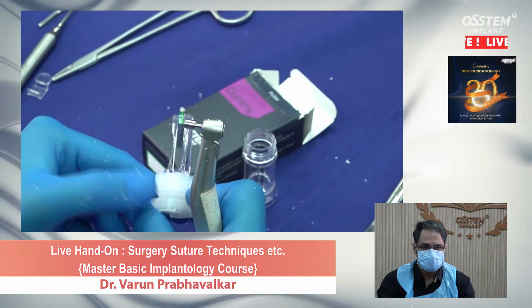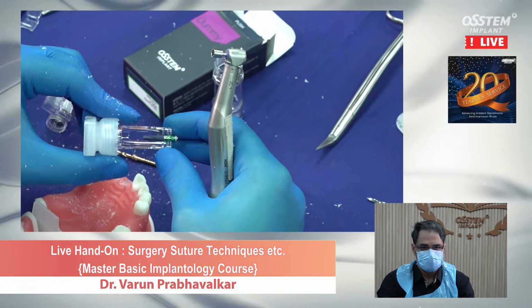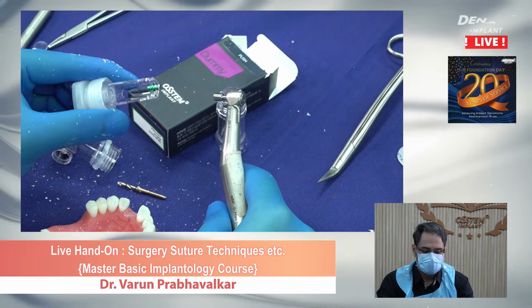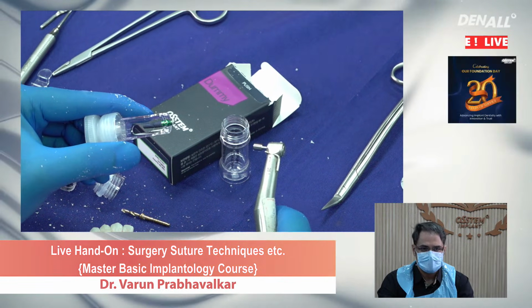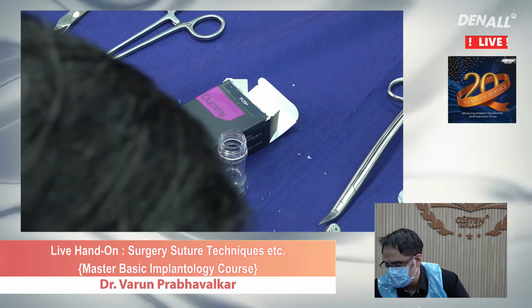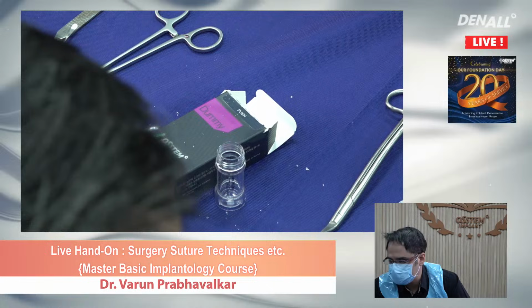You can see the packaging difference with the mounted implant, and it exhibits a mount present over there. The advantages of mount is that you do not come in direct contact with the implant platform, and you can place the implant without actually coming in contact with any part of the platform. Also, mount gives you idea of parallelism.